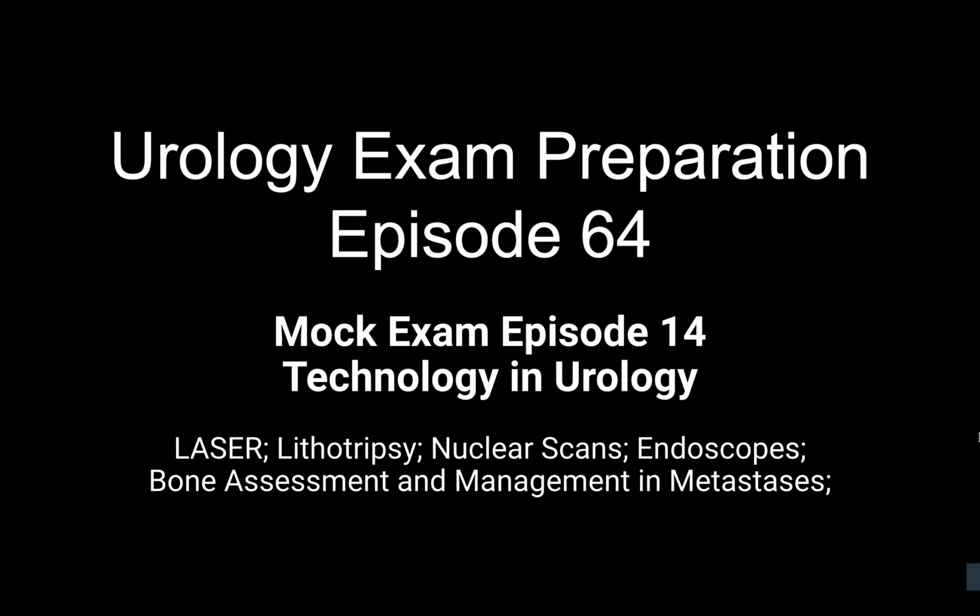The use of digital is very good for TCC diagnosis. So if you have a high volume of upper tract TCC, it's very handy to use it very selectively, not routinely for stones as of now.